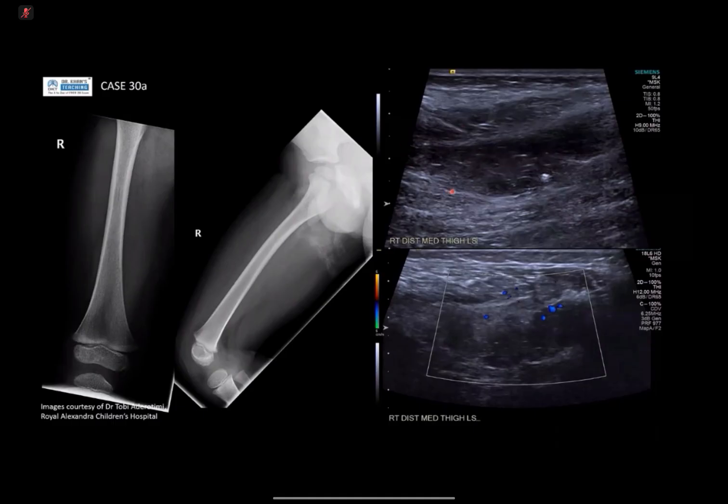Unlike hemangiomas, which are tumors, these are more ill-defined, and they also demonstrate very low flow. Some papers say you can get a bit of arterial flow, but generally they are really slow flow. So you've got to turn your Doppler settings down or use power Doppler to even pick up a little bit of flow. And the giveaway sign is the phleboliths within it.